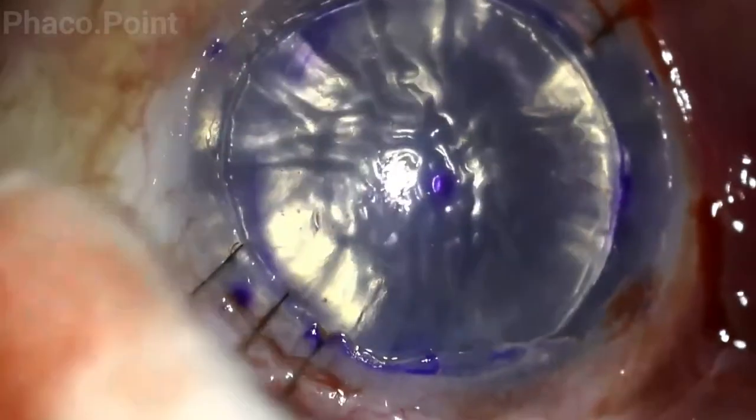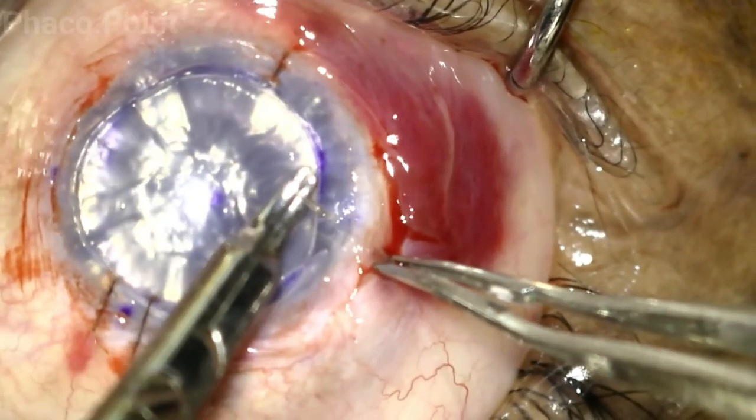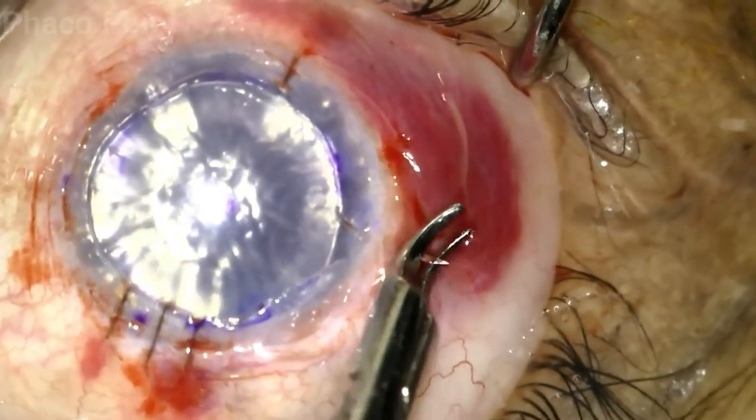At the end of suturing and burying the sutures, this is what it should look like. The rest of the video will depict a few more interrupted sutures taken at different areas of the limbus.